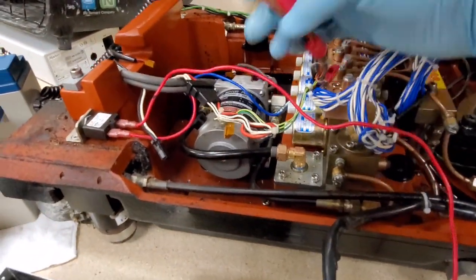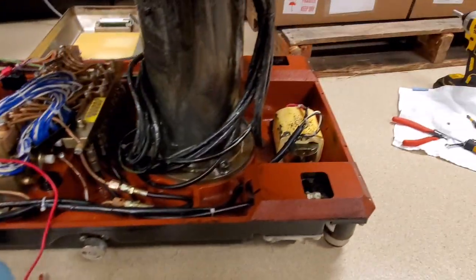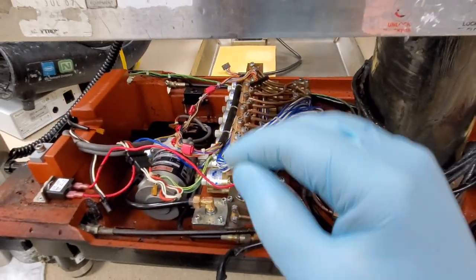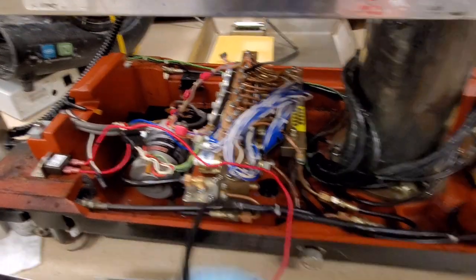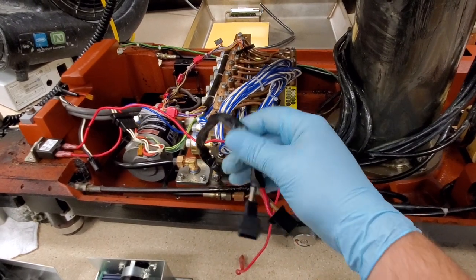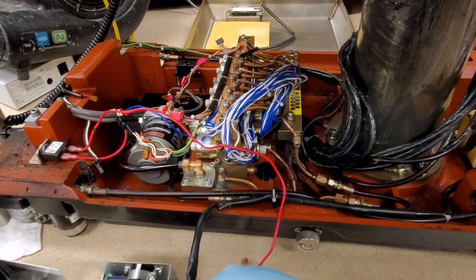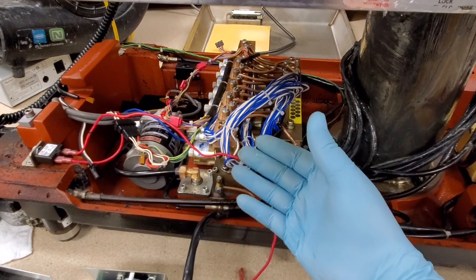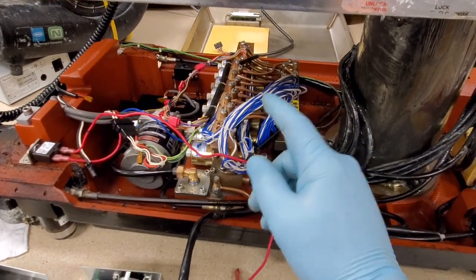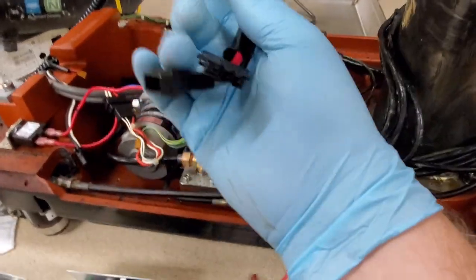Even some of the controller wiring was leaning up against the AC lines. So this is going to have to be a whole rebuild. The problem with Skytron and this table is that they don't sell existing wiring harnesses or wiring kits. In other words, I'd have to rewire the whole table from scratch. They say I have to source the wiring locally and do it piece by piece, strand by strand.